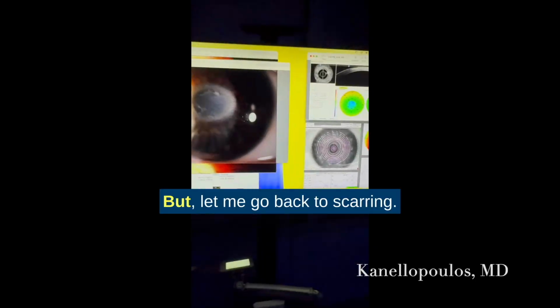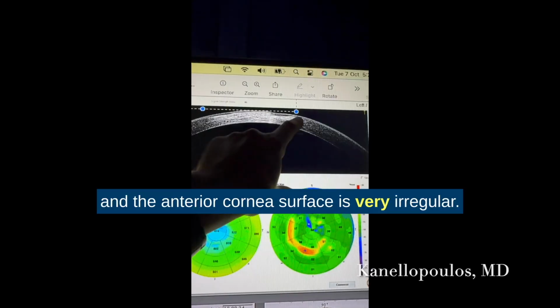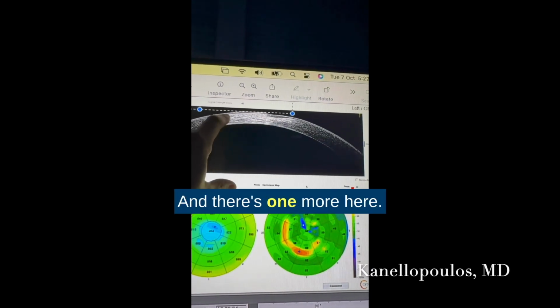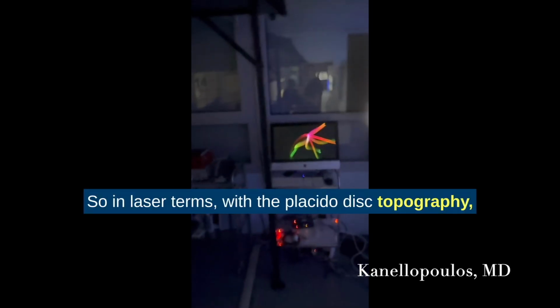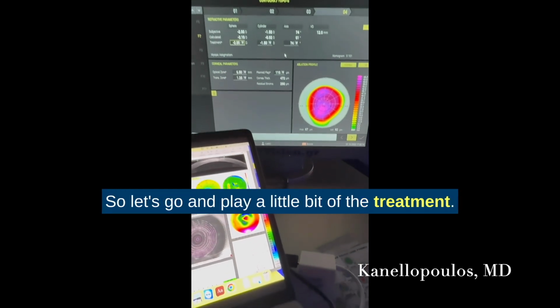But let me go back to the scarring. We can see that most of the scarring is anterior, and the anterior cornea surface is very irregular. You can see this big indentation here, and there's one more here. So in laser terms, with the placido topography, this would have been her treatment. So let's play a little bit of the treatment.